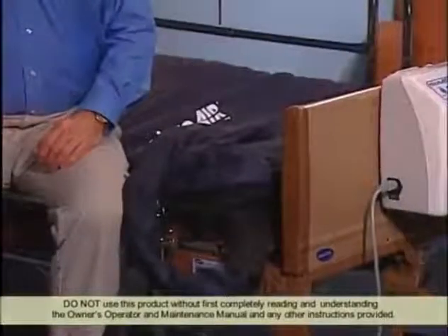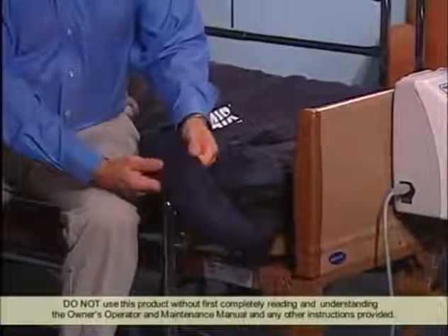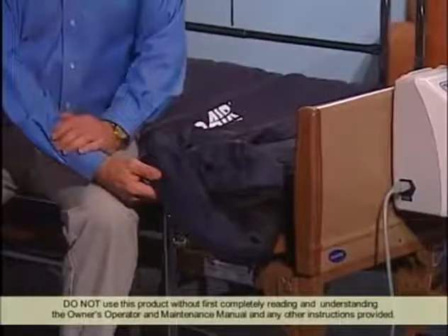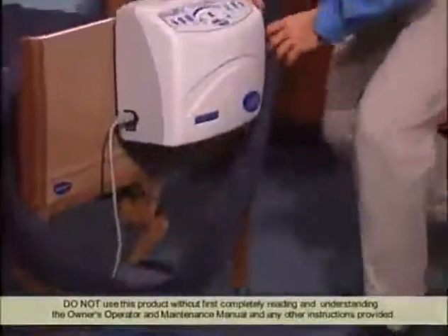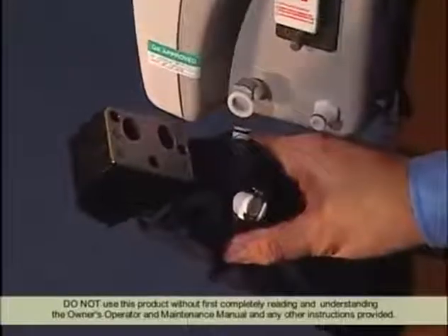Now attach the hose. It's permanently connected to the mattress. It has a protective cover around it to prevent it from getting kinked or from getting in between the mechanism of the bed itself. It's an extra layer of protection against wear and against any type of damage. When attaching it to the power unit, make sure that you wrap it around and underneath like this. Then plug it in. The connections themselves are a little bit different.